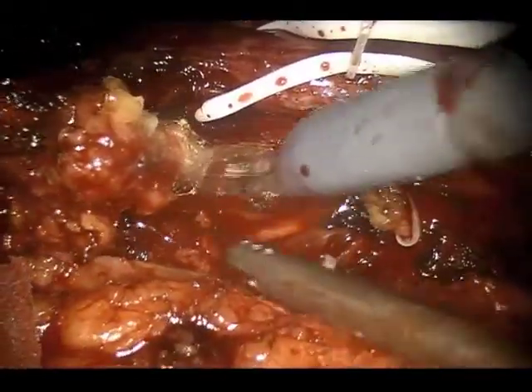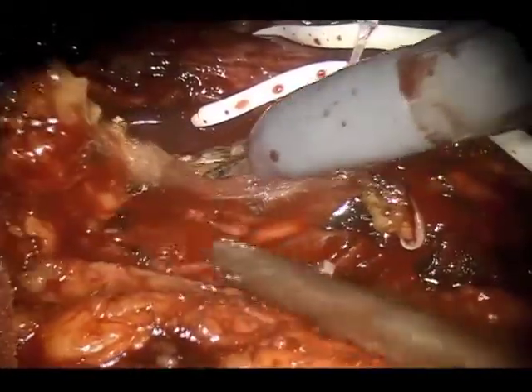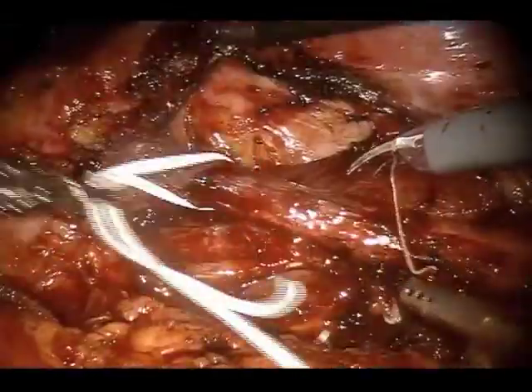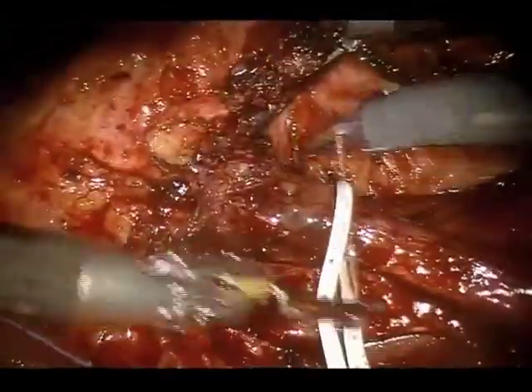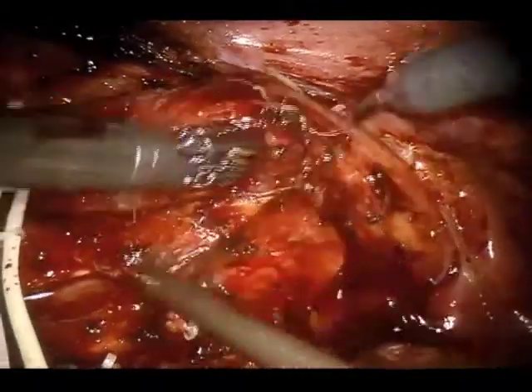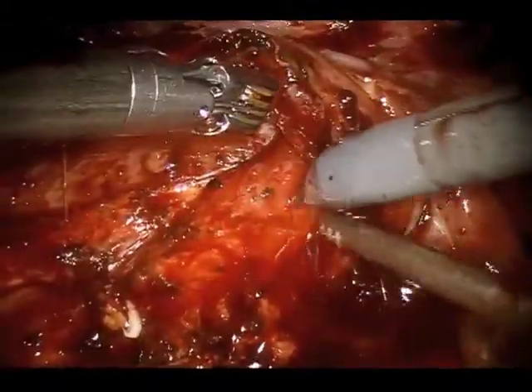Inflamed tissue and fibrotic plaques were excised and sent to pathology. Tissue was ultimately benign. The ureter was fully exposed from the renal pelvis to the iliac vessels.